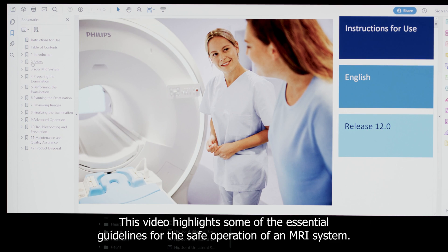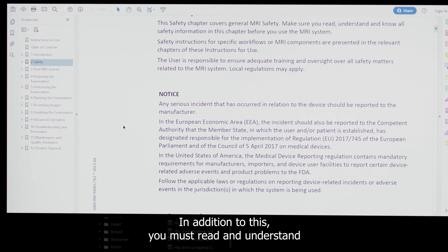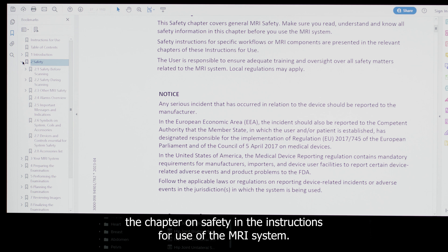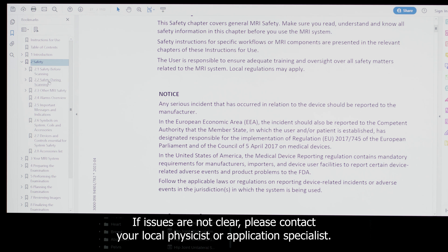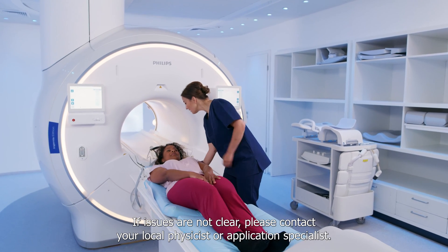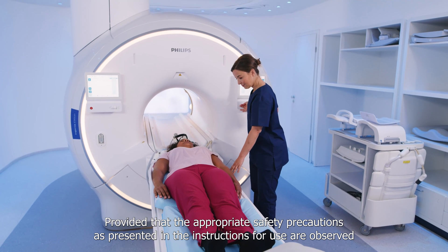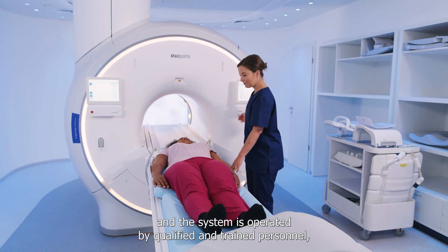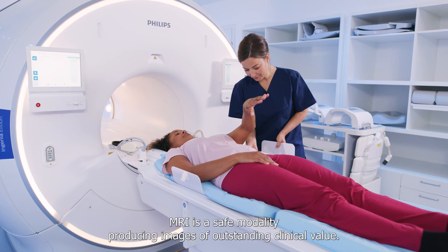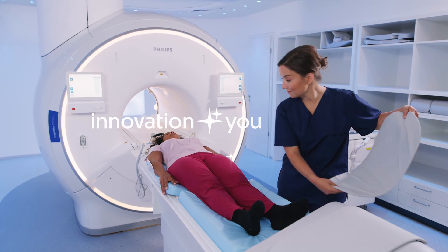This video highlights some of the essential guidelines for the safe operation of an MRI system. You must also read and understand the chapter on safety in the instructions for use of the MRI system. If issues are not clear, please contact your local physicist or application specialist. Provided that the appropriate safety precautions as presented in the instructions for use are observed, and the system is operated by qualified and trained personnel, MRI is a safe modality producing images of outstanding clinical value.